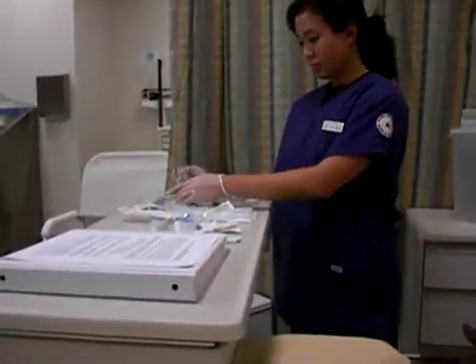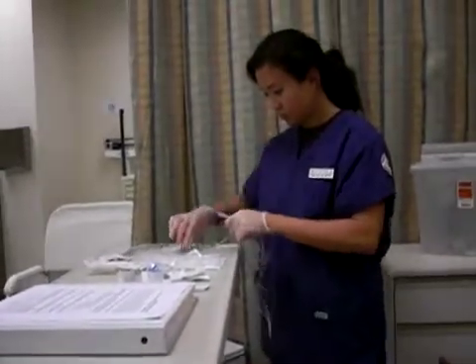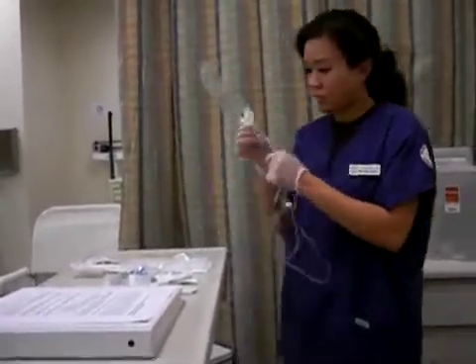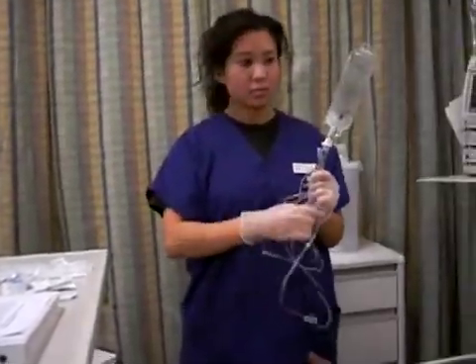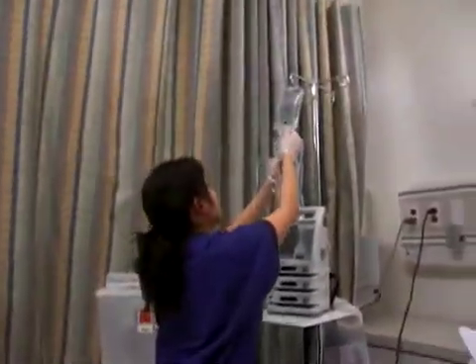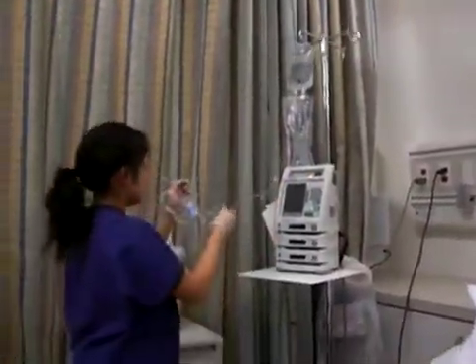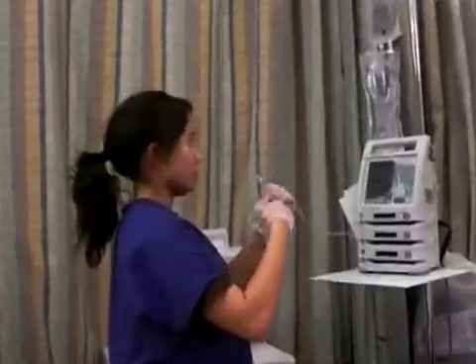The nurse opens the infusion set, maintaining the sterility of both ends of the tubing, and also makes sure the tubing is clamped. The protective sheath from the IV bag is removed and the tubing insertion spike is inserted. The spike should not be touched.